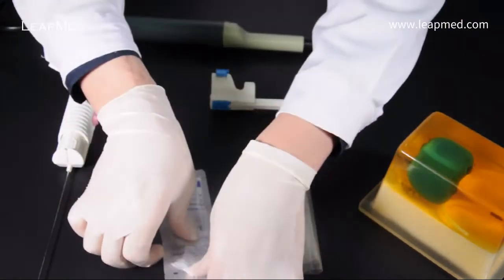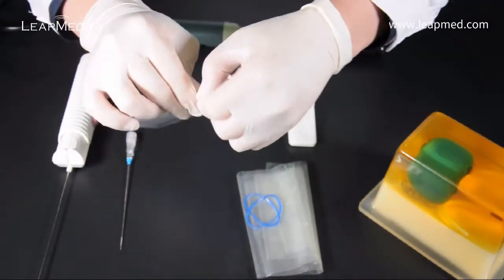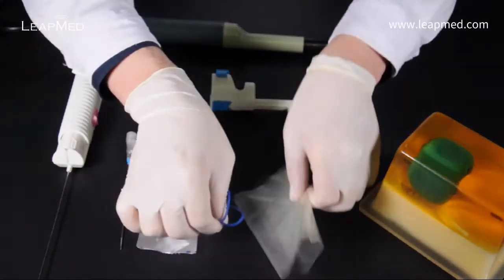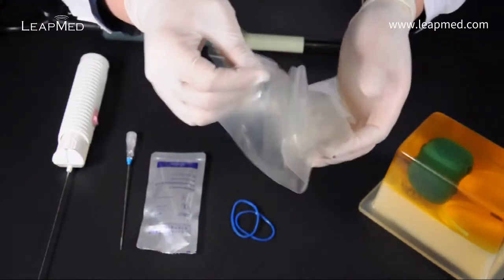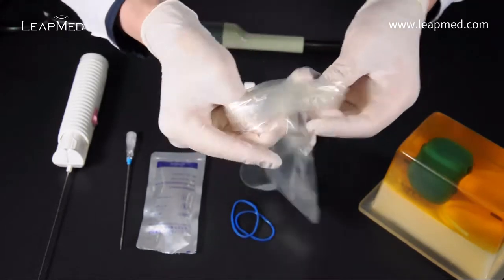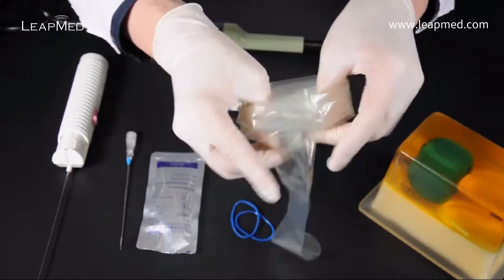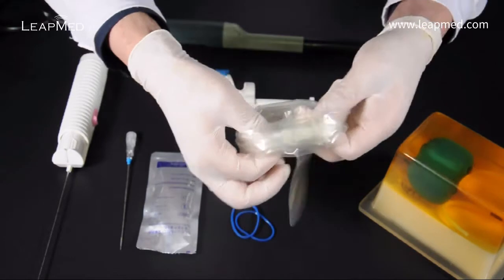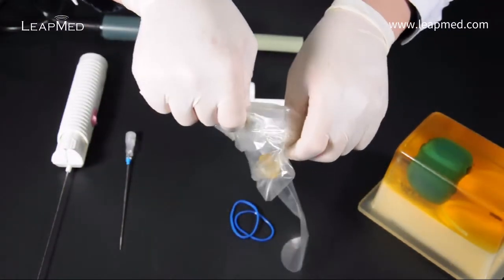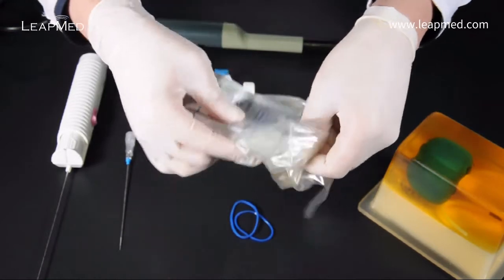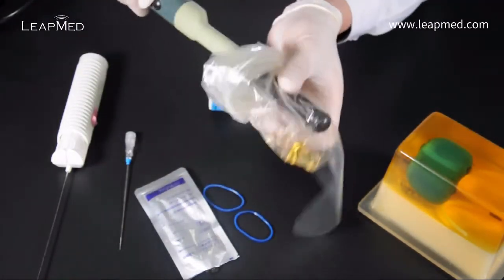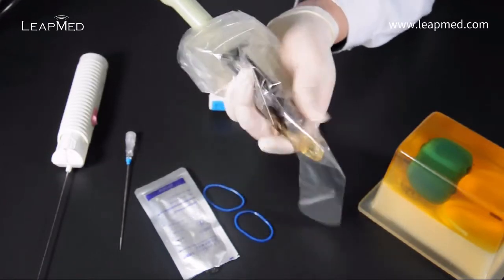First we open the sterile gel and roll the cover. We then apply gel into the cover and put the probe in.